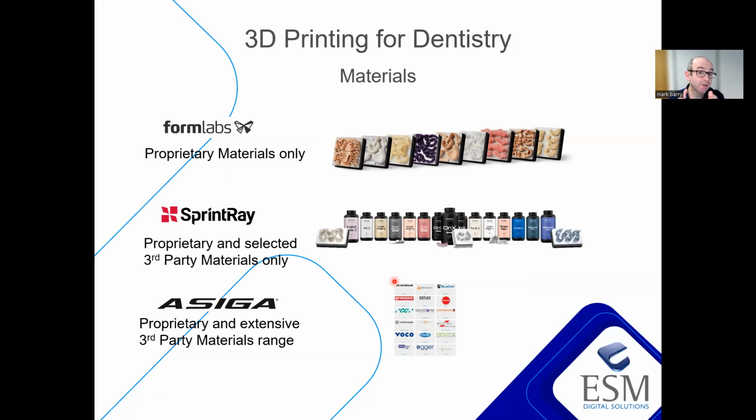What happens after the printing process? Well, that's other people's concern. So we've got a huge range of materials that can be printed on Asiga, but when it comes to washing, and more so curing, you have to make sure you have the right curing solution in place. Whereas Formlabs and SprintRay will only allow you to use materials in their printers that can be washed and cured correctly within their process. We'll be talking about curing shortly.